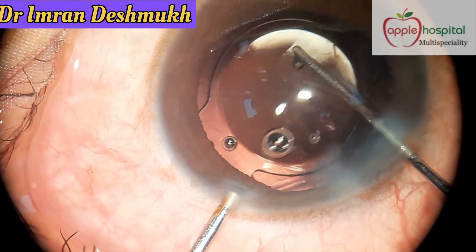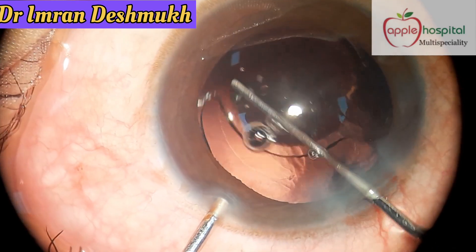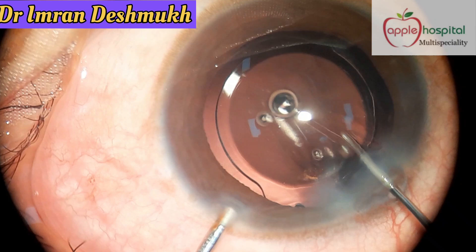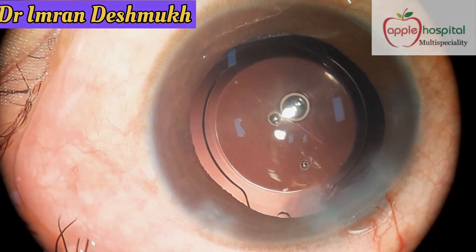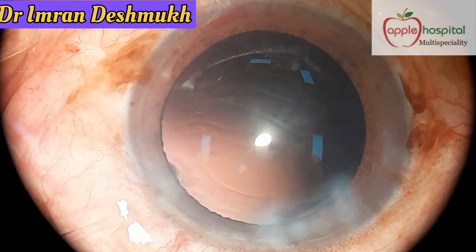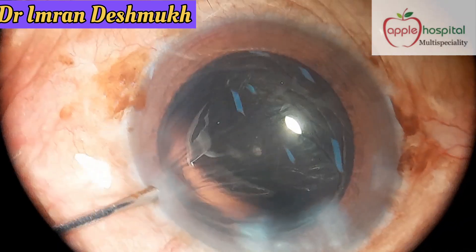You can easily rotate the IOL as it's constantly under continuous irrigation, so there's no fear of the AC collapsing. It becomes really easy, especially for a high-volume surgeon.